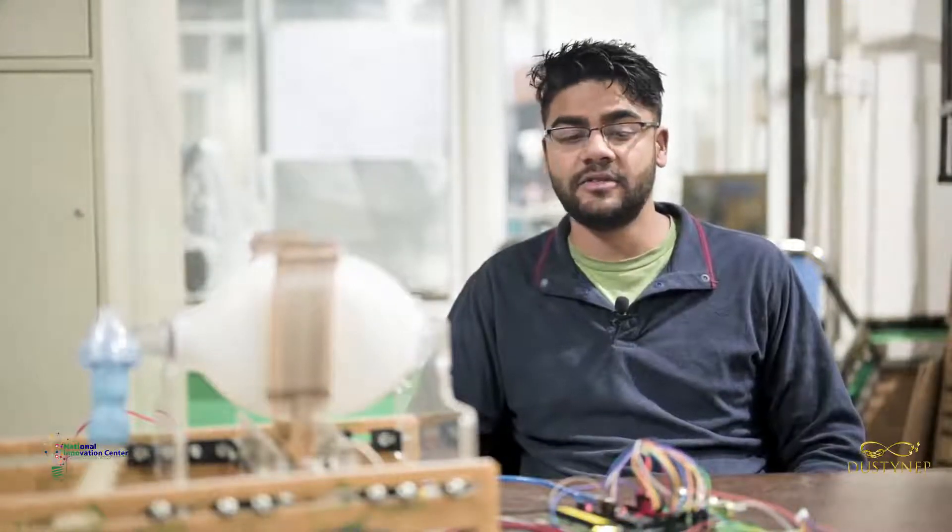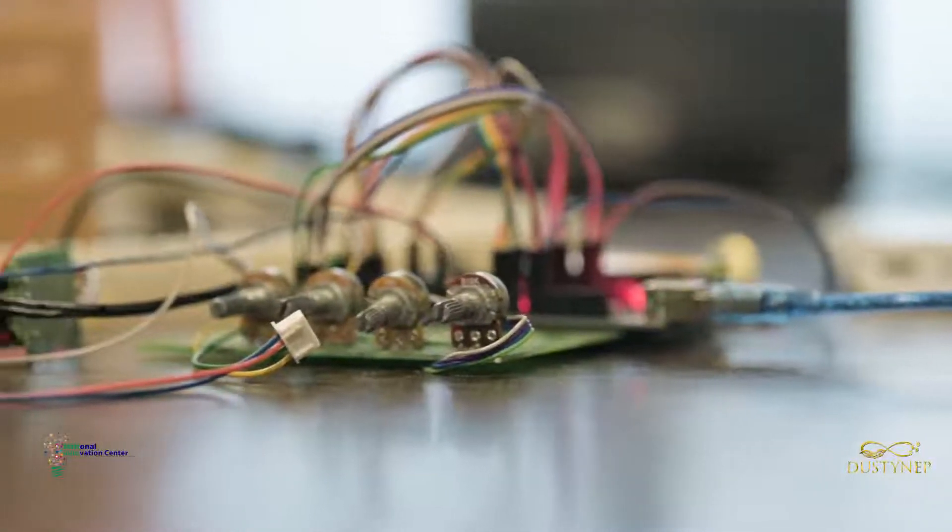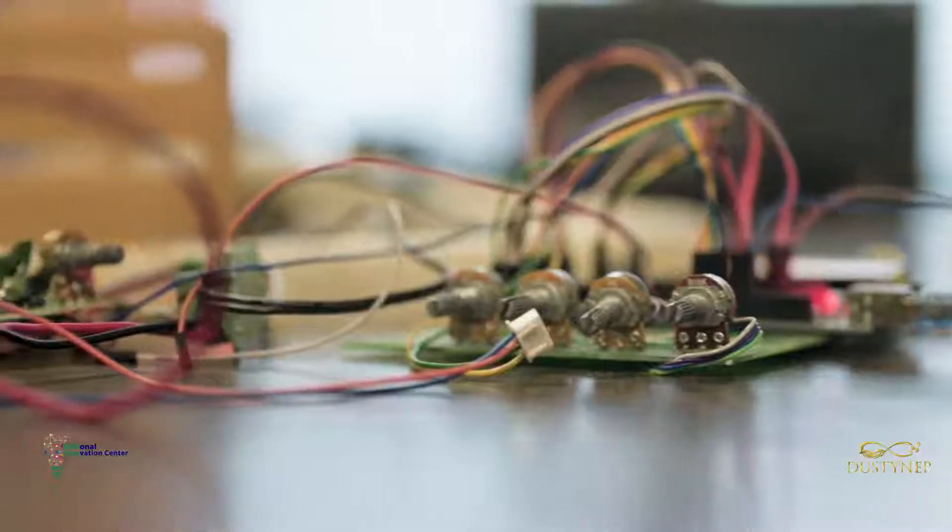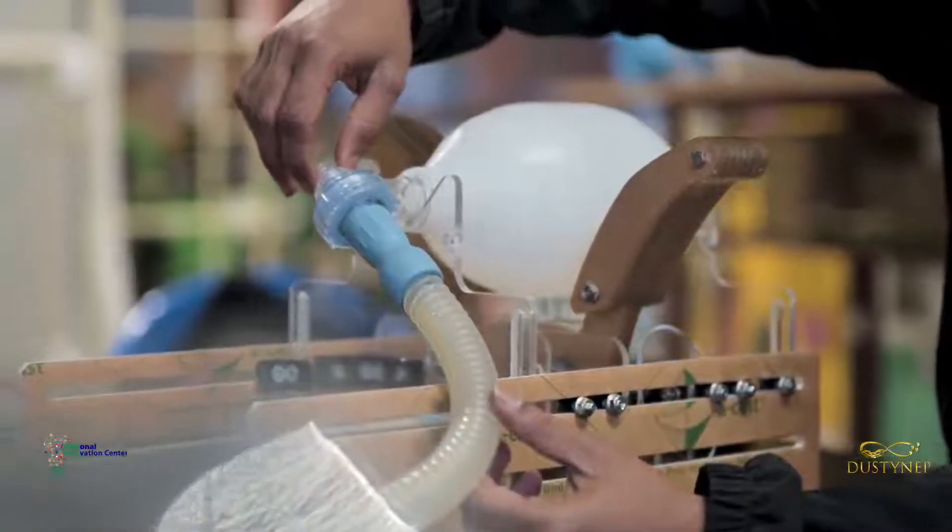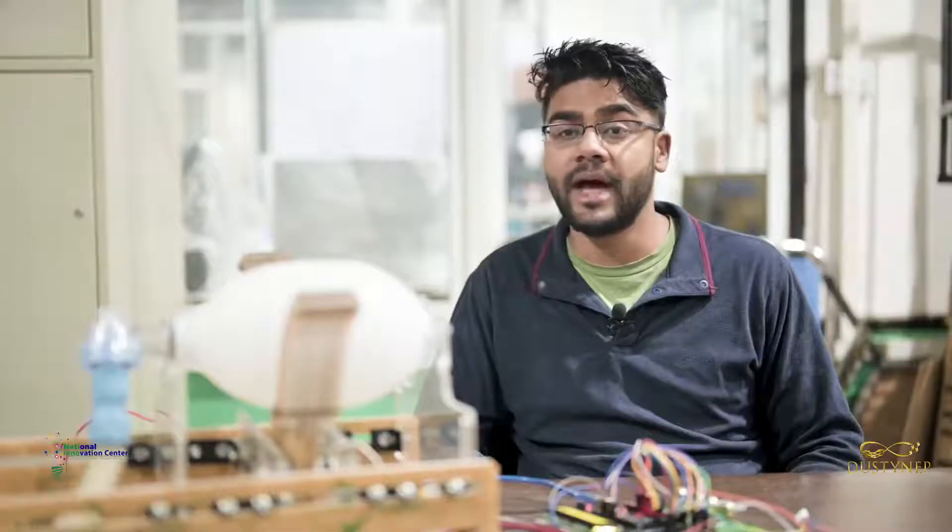This model has basically two parts: one is electronic and the other one is mechanical. The electronic part controls the in and out motion arm that pushes the AMBU bag, and the AMBU bag is what is used by frontline healthcare workers in emergency situations.